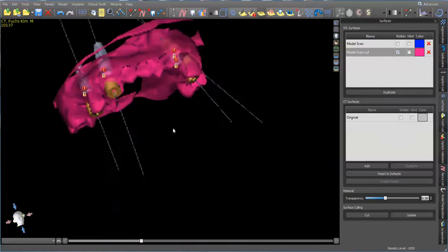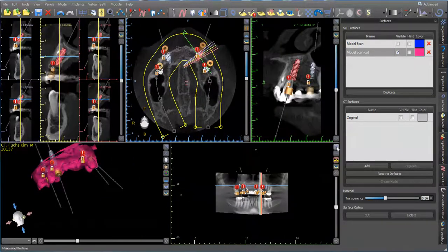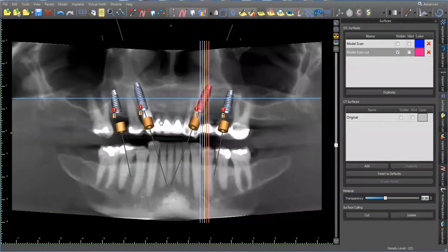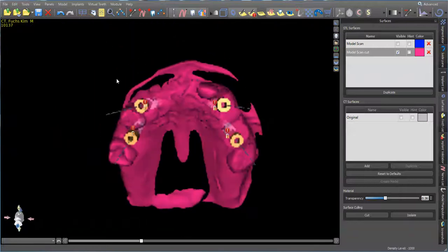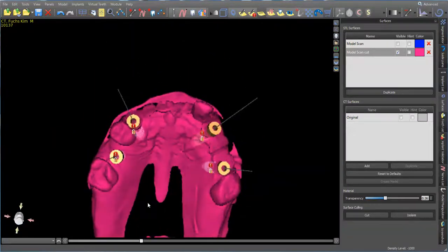So the plan of action, I'll go back to it again so we can review this. It might be a little confusing. I'm sectioning this tooth off, removing this tooth number 6 along with 7, 8, 9, leaving number 10, extracting number 11, section this tooth, and removing this 3 unit bridge. And I'm going to use this tooth, this lateral, and tooth number 14. So now I have that right here.